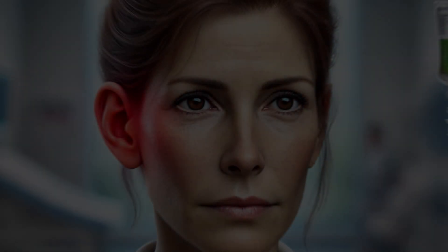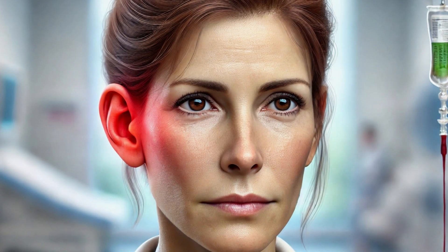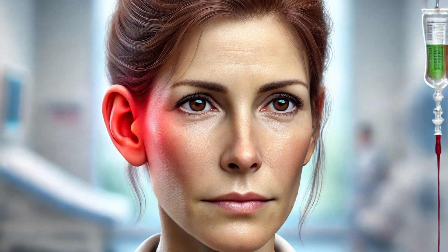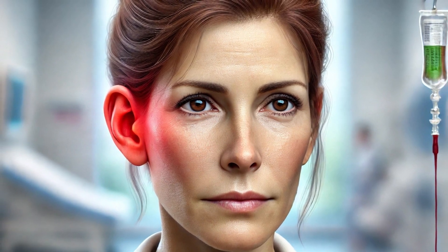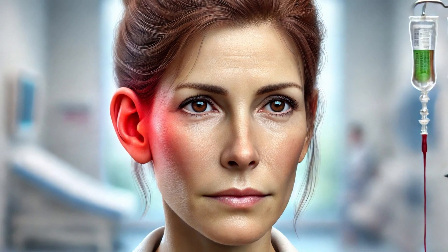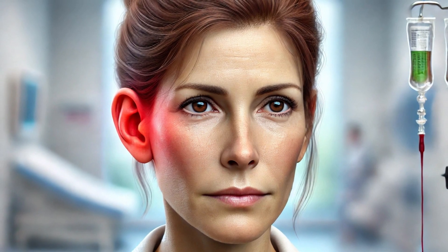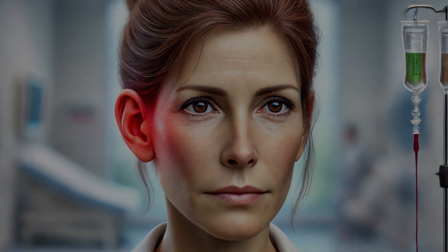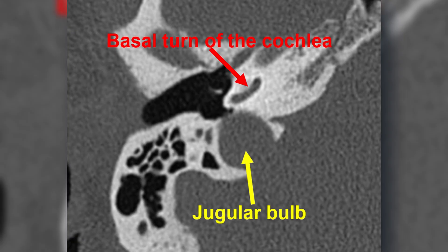A 50-year-old female patient with a history of chronic right otitis media. A computed tomography of the temporal bone was performed as requested by her treating physician. On axial section of the right temporal bone in bone window, the jugular bulb is visualized at the level of the basal turn of the cochlea, a finding suggestive of a high jugular bulb.